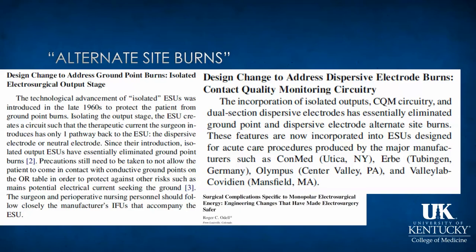Some anesthesia references make the point that we should know that these exist so that we are able to explain to people who are seeking to attribute these to our monitors and equipment, and to educate the people who are trying to attribute this complication to us.